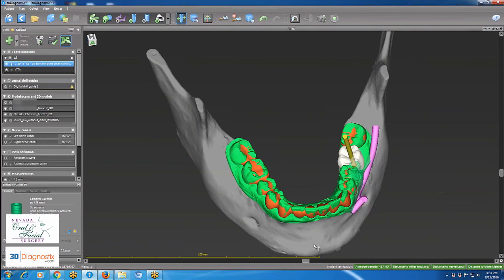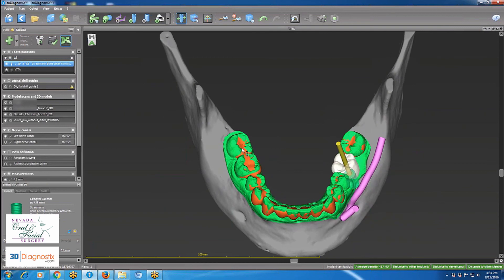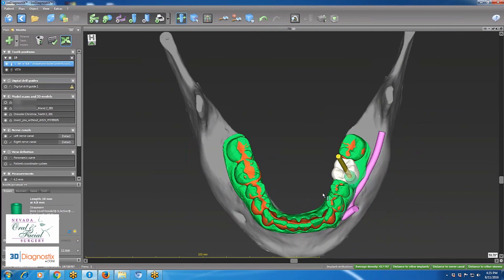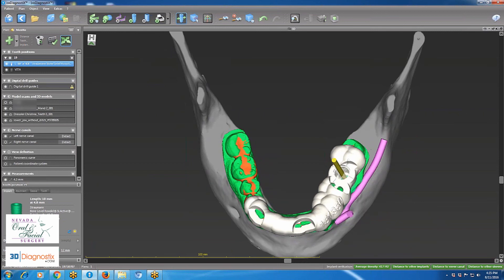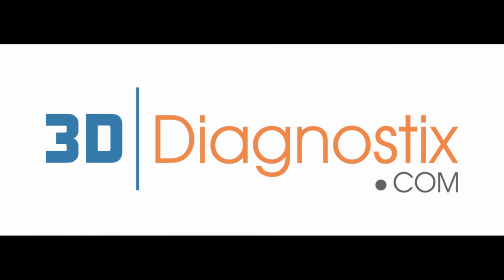Once I'm done with the plan, the next step is to register the study models onto the plan in order to fabricate a surgical guide. Finally, a surgical guide is fabricated by 3D Diagnostics, compatible with the Strawman Computer Guide Kit.